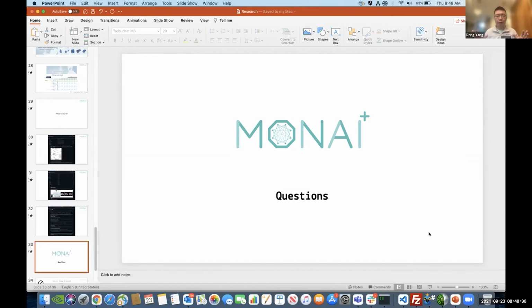So for the window, the intensity window and the patch size, right? Yeah. So for intensity window, I feel like it is necessary to do this kind of windowing for specific regions, like a specific object. Let's say for bone or for soft tissue, if you select the right window, then your model training will be very efficient. And for the patch size, it's a good question.